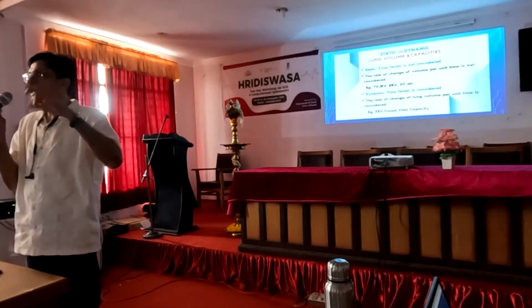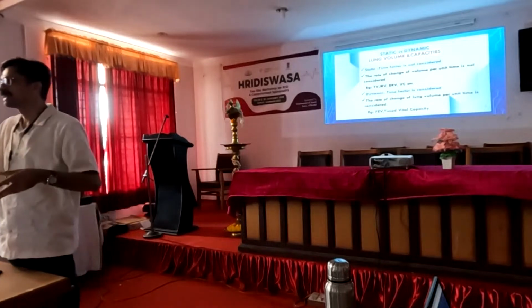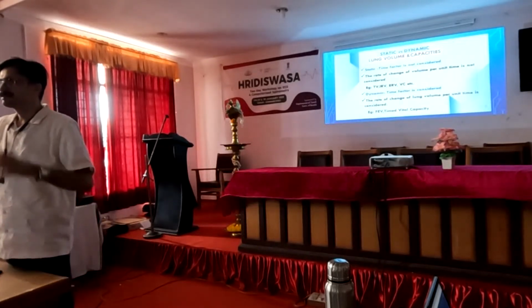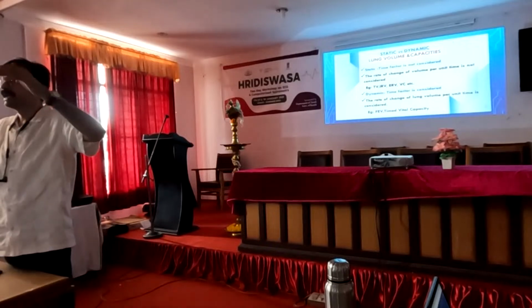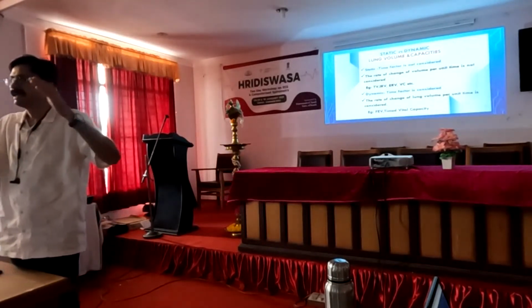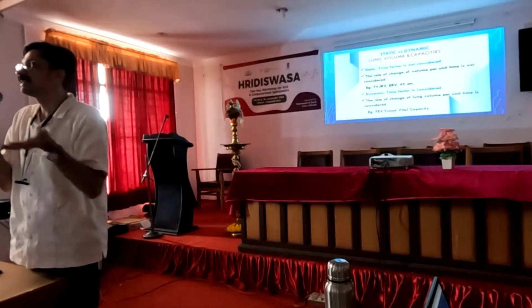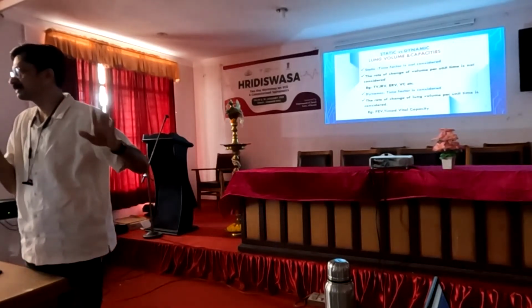But in clinical practice, this dynamic lung volume and capacities are more important, clinically relevant, because with the time we are analyzing the different airflow rates, so we can differentiate obstructive lung disease and restrictive lung disease by analyzing these dynamic lung volume and capacities.